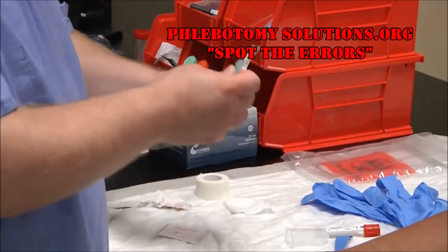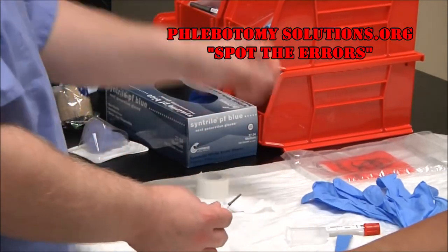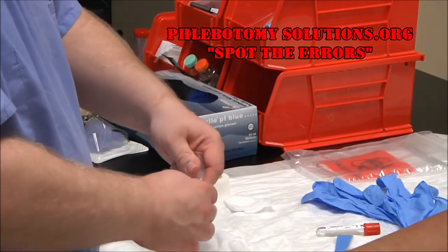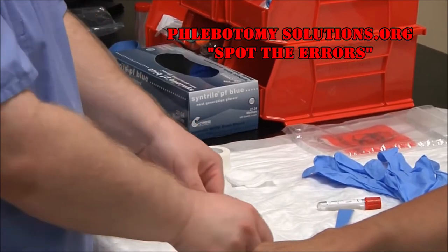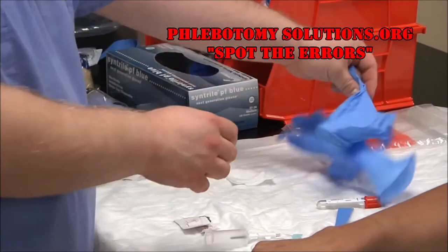Make sure everything is good on your needle. Remove the sheath from the multi-sample end and attach your holder, twisting it on tightly. At this time, go ahead and cleanse your patient with your gloves on.